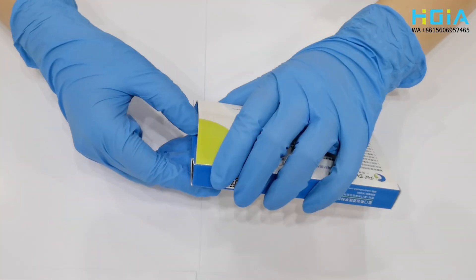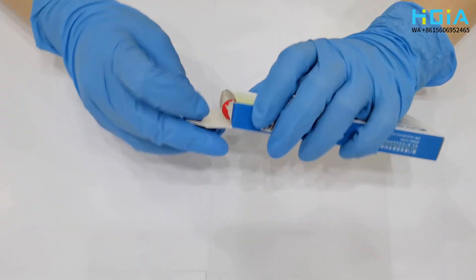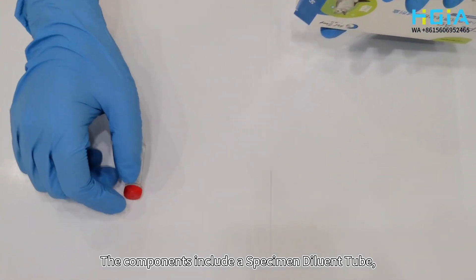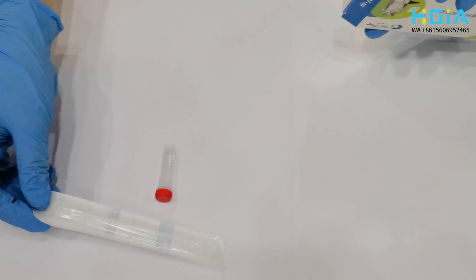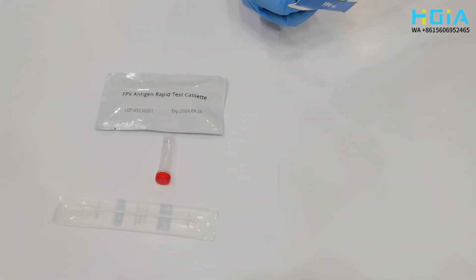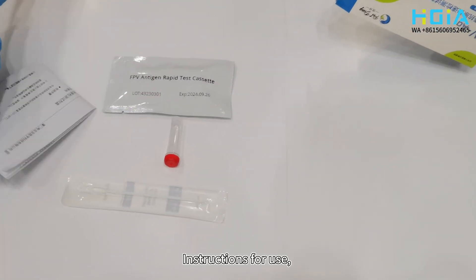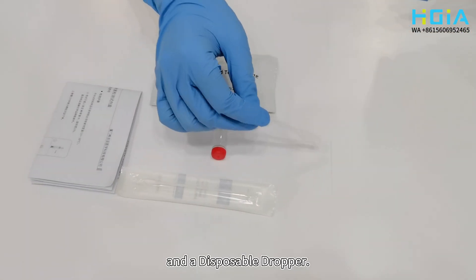Open the package and take out the components. The components include a specimen diluent tube, a disposable swab, a test card, instructions for use, and a disposable dropper.